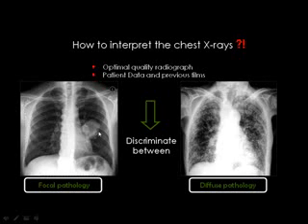The focal lung lesion means that you have a single or double or triple lesions in the lung, but the rest of the lung is free. While the diffuse lung pathology means that both lung fields are almost completely infiltrated by a pathology.